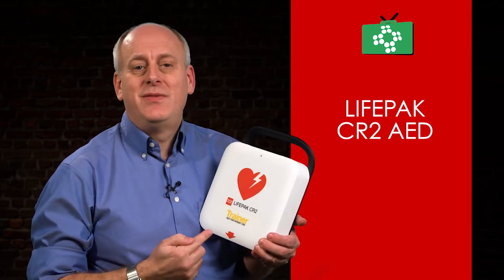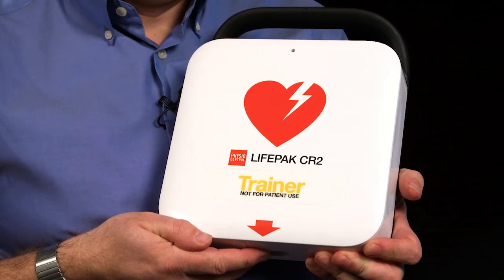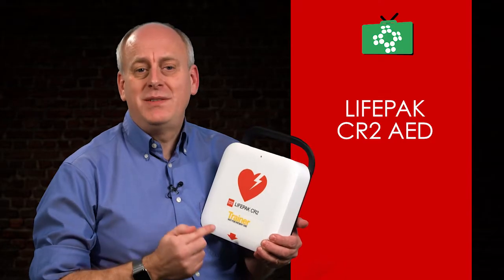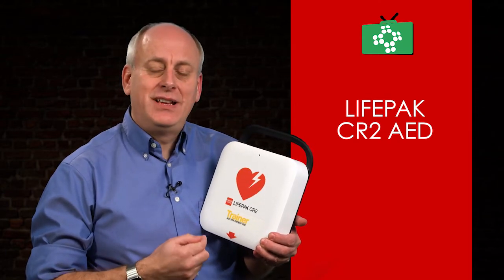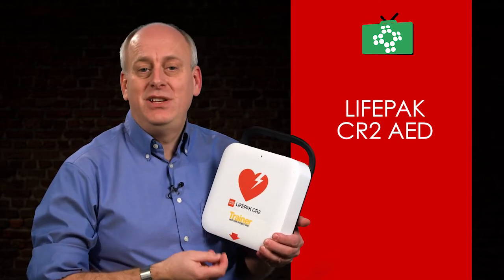The CR2 is available in different versions, and the basic versions connect to Wi-Fi, with the advanced versions also having 3G connectivity. What this means is that the data and maintenance of the units can be transmitted to a central point, allowing notifications that pads or batteries need to be changed, and notification when the AED has been used.